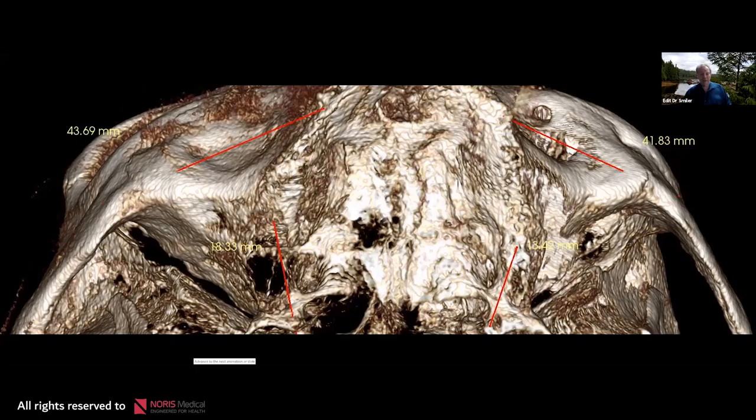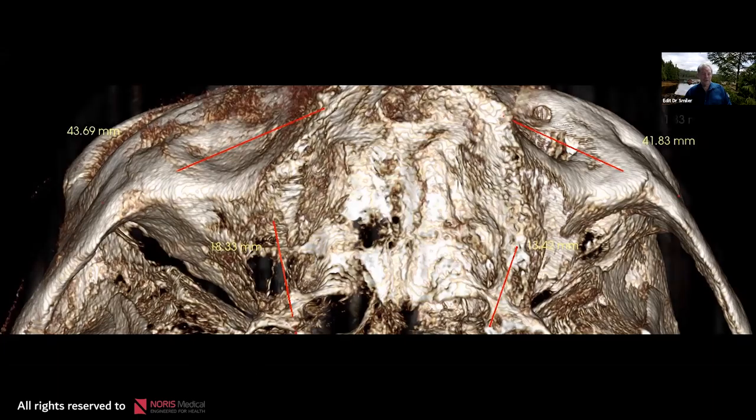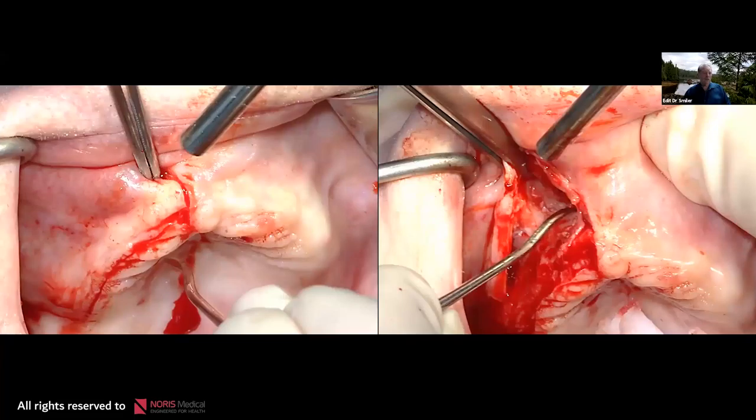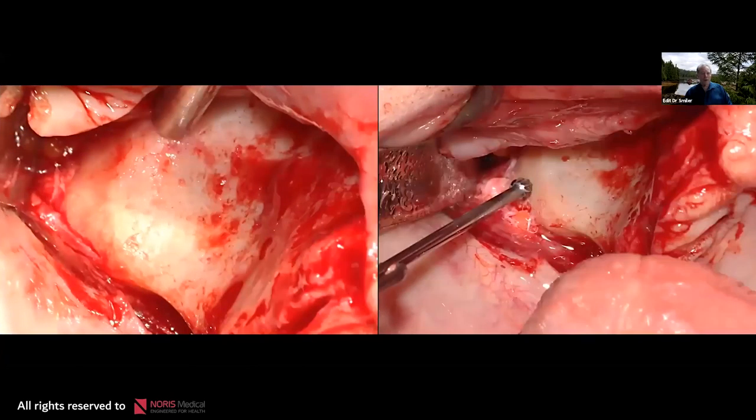There is a nice path from the ridge to the zygoma, and the concave lateral maxillary wall — probably a Zago type 3 — is actually helpful because this patient had chronic sinusitis on the left side, so we want to avoid going into the antrum as much as possible. Standard dissection for the zygoma implant: starting from the anterior nasal spine anteriorly, then the crestal incision with a vertical relaxing incision. We have to be very careful about where we make our pilot hole in this lateral wall — avoiding the sinus on both sides.